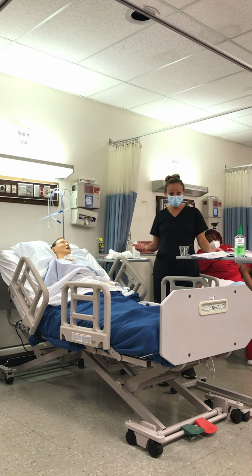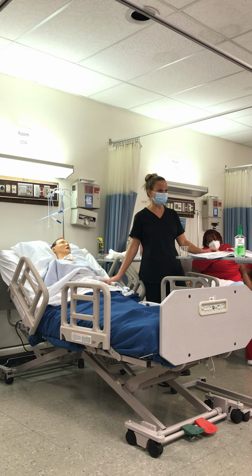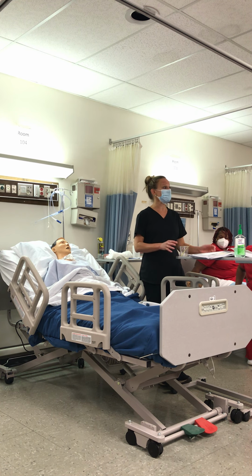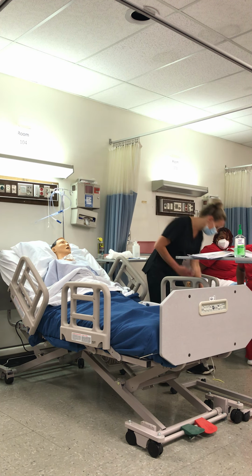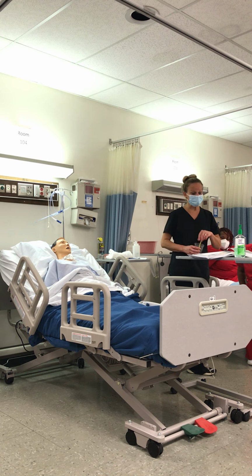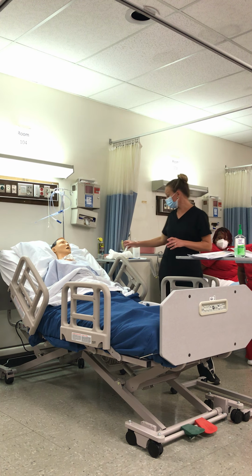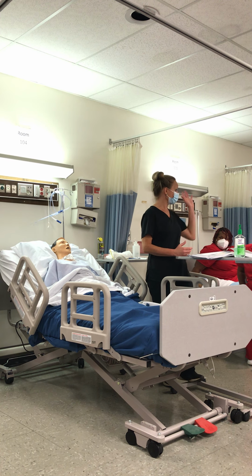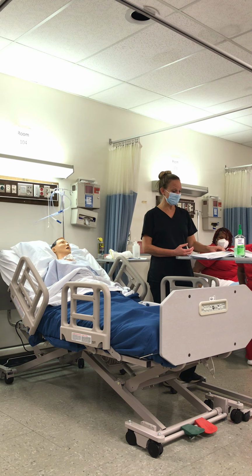When I explain my procedure, I'd say, this is what I'm going to do, and try not to let it get you anxious. But this is one thing you can do: whenever you feel concerned or worried, or you get anxious, or you're having trouble breathing or anything like that, I just want you to raise your hand. Give me a signal to stop, okay? So you want to make sure you establish that with them, okay?